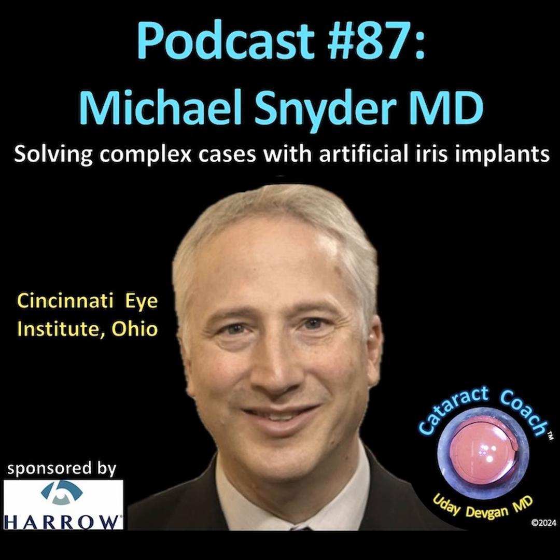No, for sure. Now, you've also used this in more complicated situations where you're even fixating the IOL to the back of it. I've seen this as well. Yeah, so in patients who have a completely aniridic and aphakic eye with no capsular support structures, there's a bunch of different ways I've done these. Initially, I would suture the implant lens to the iris device and then suture the implant lens to the eye wall. And then I started suturing the implant lens to the iris device and suturing the iris device to the eye wall. And then I started doing them separately. I would suture the implant lens and then, using the same sclerotomies, suture the iris device.